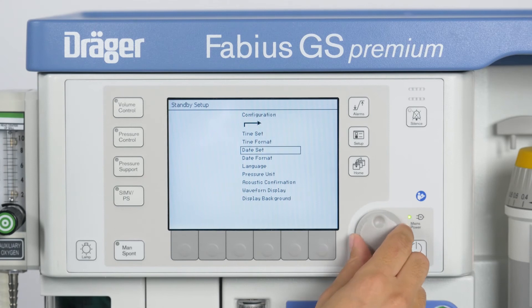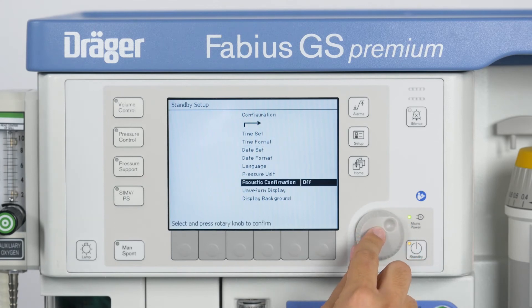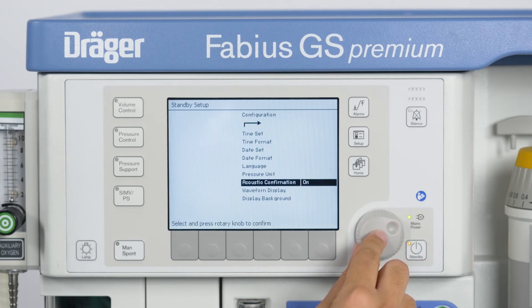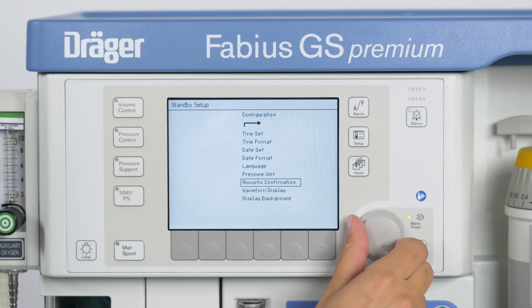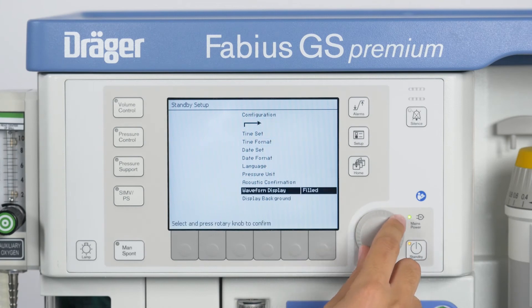If Acoustic Confirmation is set to ON, a tone sounds every time the rotary knob is pressed. The Fabius GS Premium also allows you to change the layout of the pressure waveform.